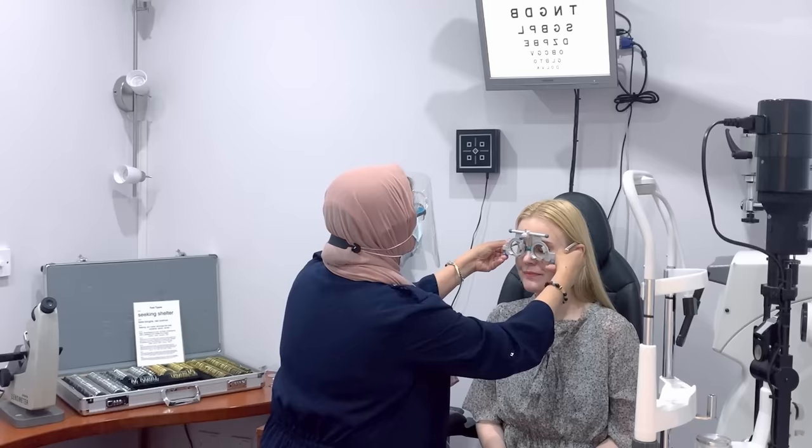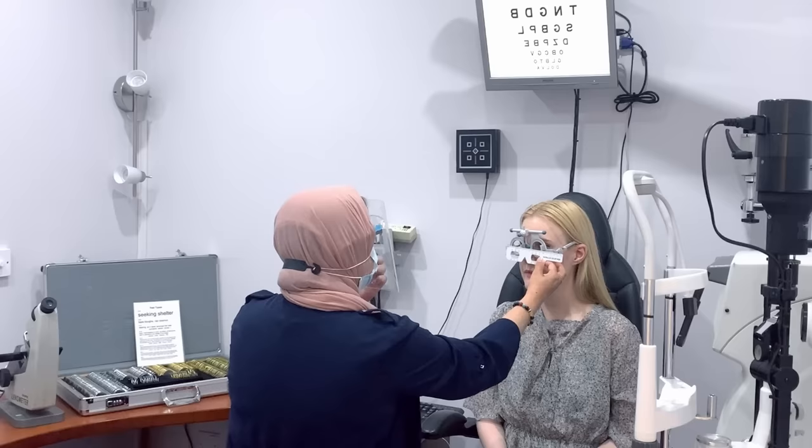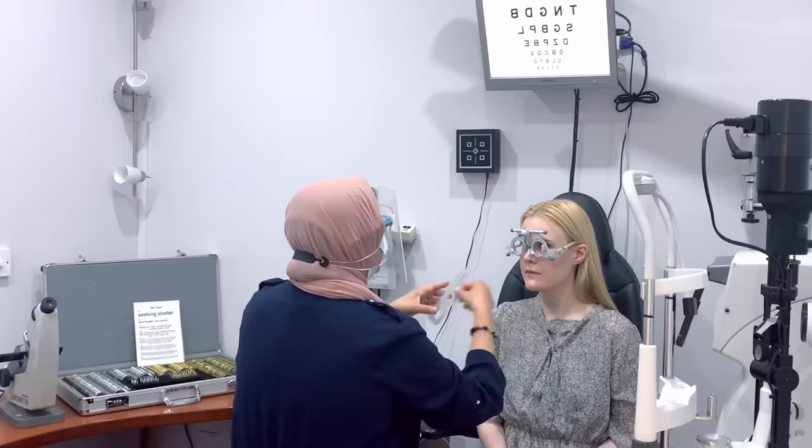Yeah. Okay, that's great. So what I'm going to put up is the current prescription that you have, and we'll go from there, yeah? Okay. Let me first of all just take a measurement from you. If you look at me a minute, just look at this eye, and then look at this one. Great, thank you. Perfect.